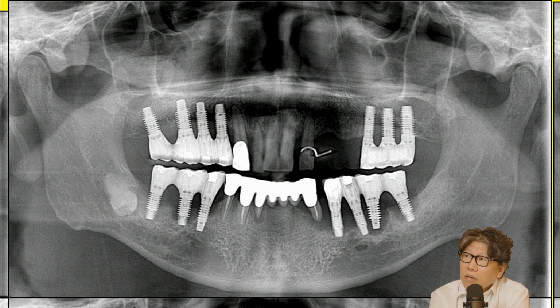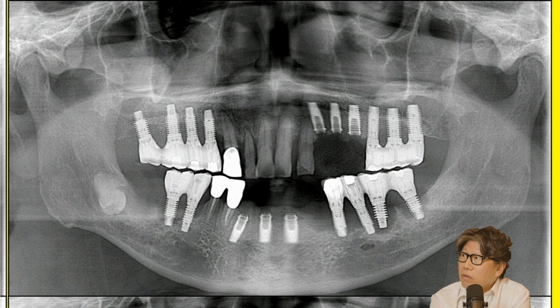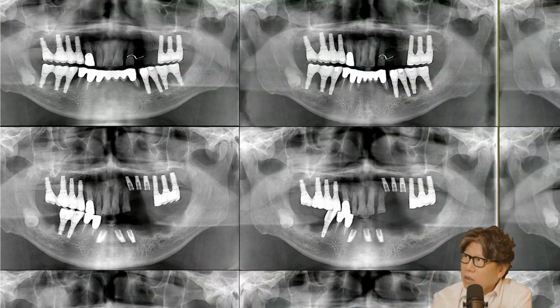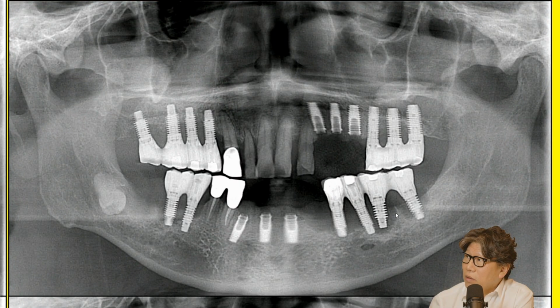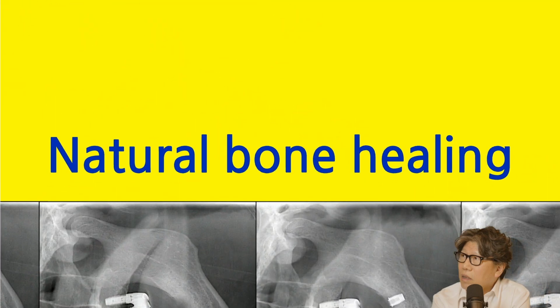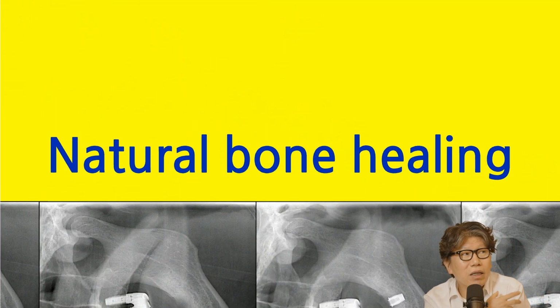Recently, his son was treated, his wife was treated, and he brought his wife with him. Anyway, it's serious. So he just asked me to do it again. So I put it in and took it out. It's worse here, actually. If you look here, it's almost like you can't do it, right? It's almost like that here. But we're not worried, because the patient is healthy. So we put the implant in, and we're hoping for natural bone healing.